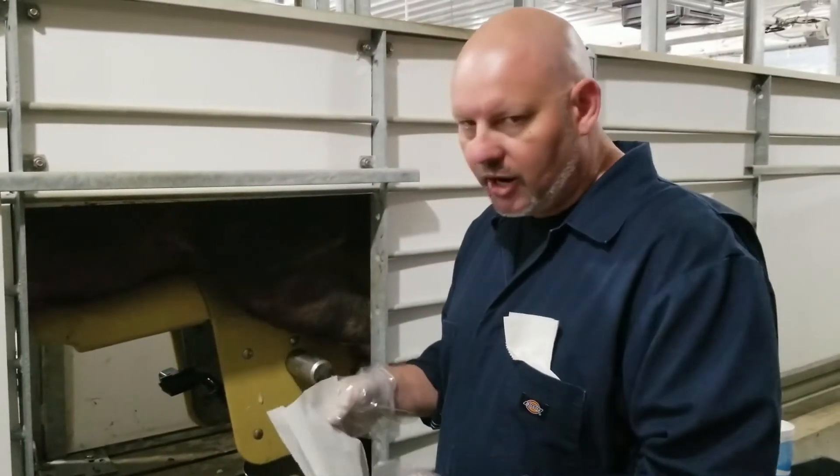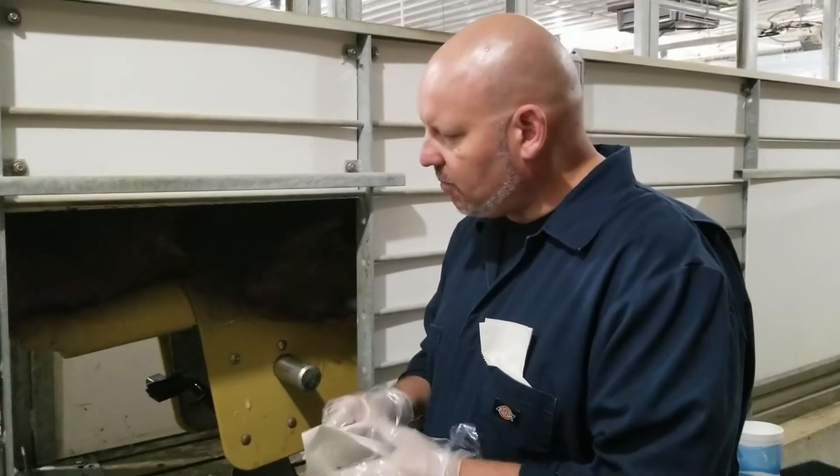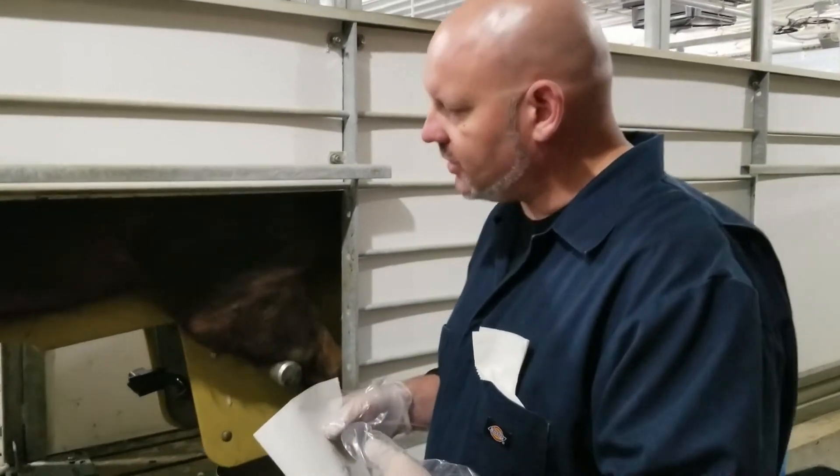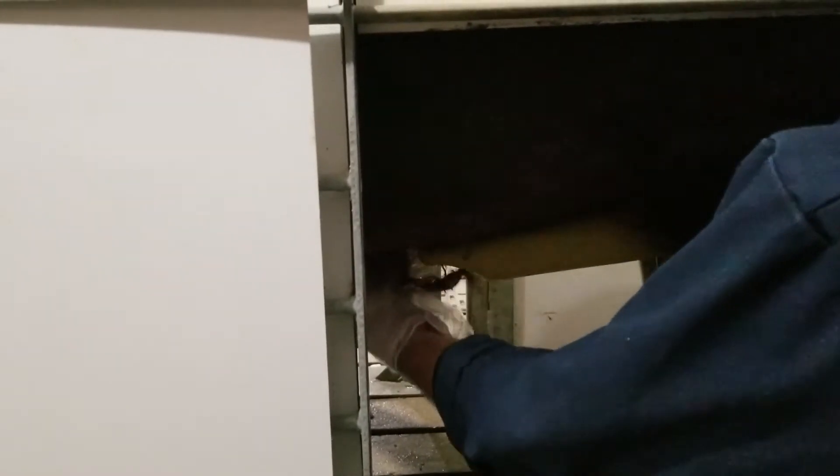All right, here we are out at the barn. I'm all closed up, paper towel on my hand, boar is thrusting, so we're going to walk through the process. First thing we want to do is reach in and make sure that we get all the urine out of the sheath. I'm going to squeeze from the back to the front, make sure all that's out of there. I'm going to take my paper towel and put it in my hand still with my poly gloves on.